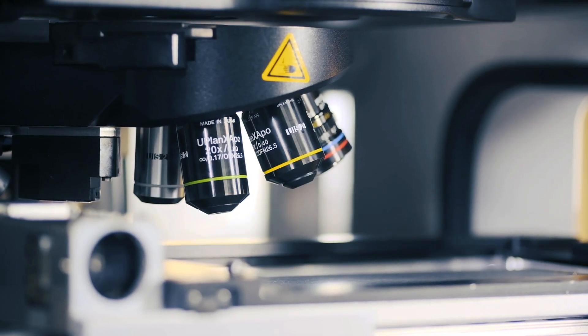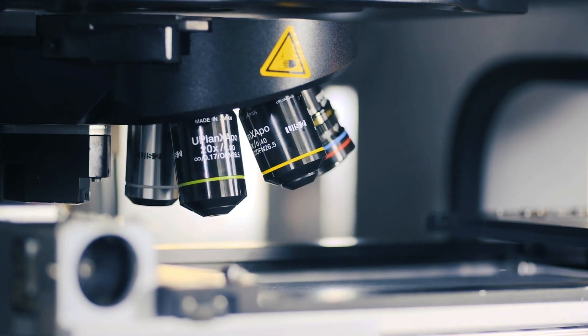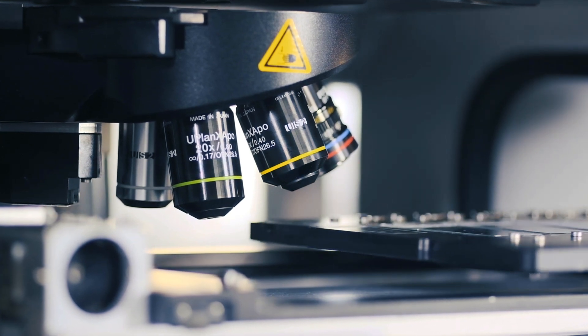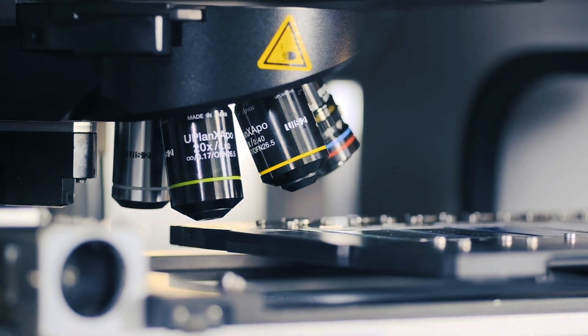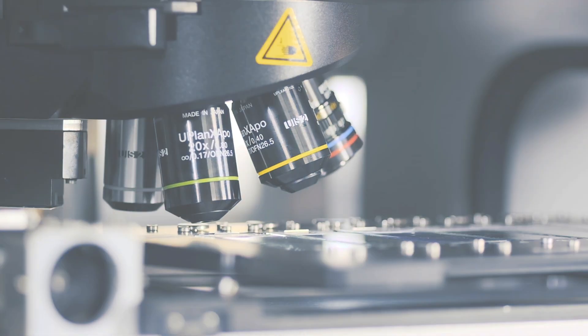With leading-edge optics and innovative features, the VS200 slide scanner improves experiment data quality and workflow for many applications.